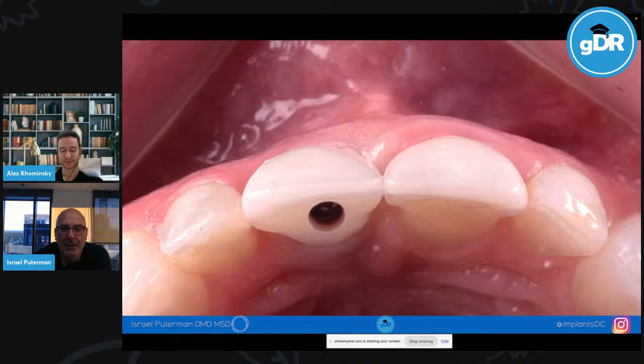But I look at it from the occlusal standpoint and I say, okay, well, I used to have nice big contour, and do I really want to leave it like this or not? That's always the question of, is good enough good enough? There was a complication and now it's good enough. Do I leave it like this or do I want to go that extra mile? Another expression I use a lot is, the enemy of good is perfect. Do I want to shoot for perfect or am I happy with good? Well, I'm a glutton for punishment, so I am shooting for perfect.